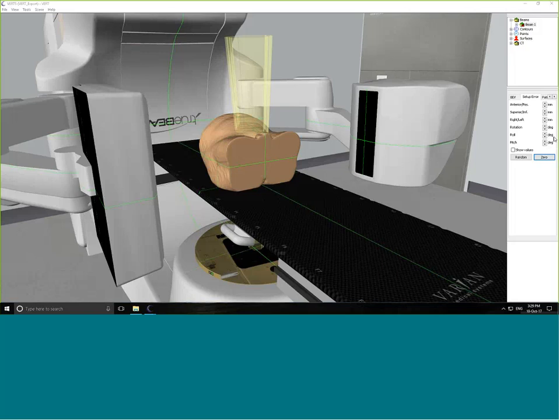Okay, just moving down from that one, can you save matched images to check later on? It's a good question and something we did discuss internally here. That's from Simon and James at Stoke. One of the things we thought about was being able to save the matches, or to save the position you're going to be moving to, the actual shift, I should say. We did discuss it, and we thought we were going to have something in place for that. But again, to avoid any hold-ups, we thought it was just as easy to record those values for this first version, and then maybe look at having a saved match feature in the next release.